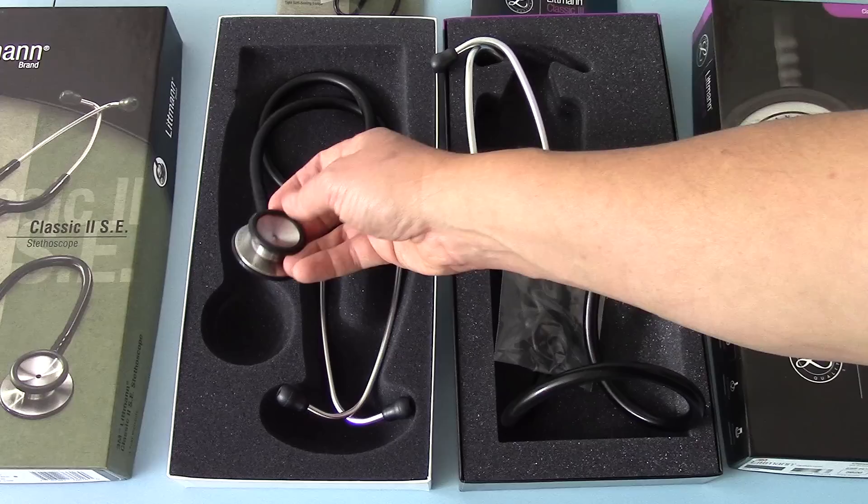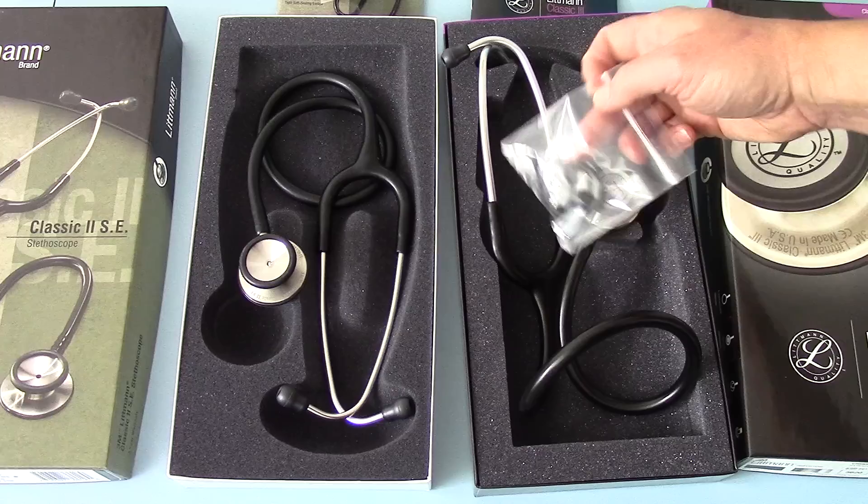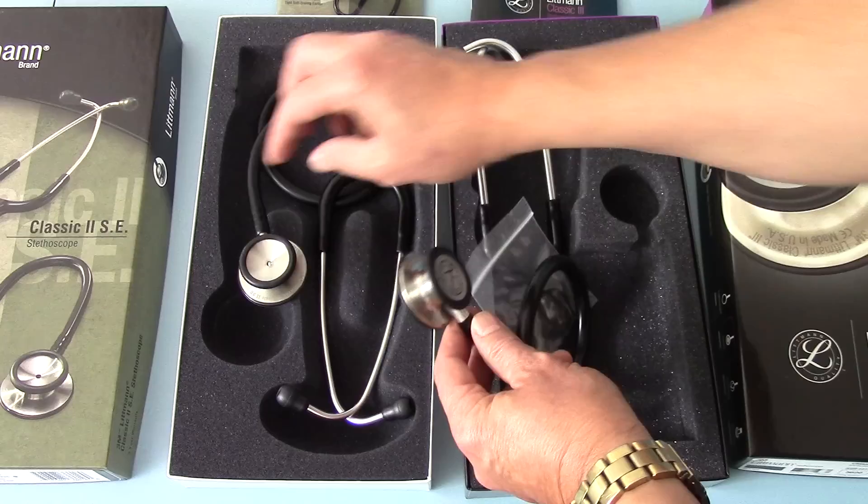Traditionally the Classic II SE had a diaphragm on the large aperture side and an open bell arrangement with no ability to put a diaphragm into that. With the Classic III you have two diaphragm setups as it's presented to you, but this ring does allow you to convert that back to the standard bell setup if required.